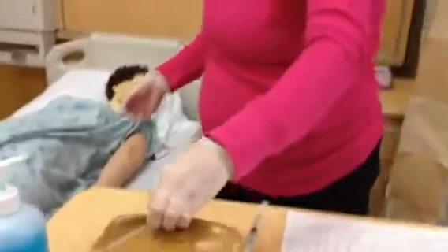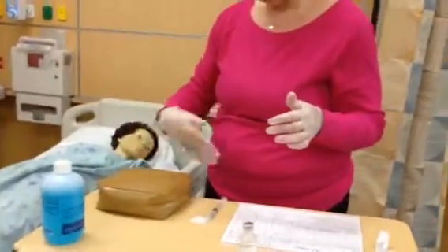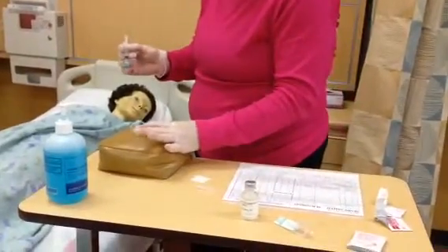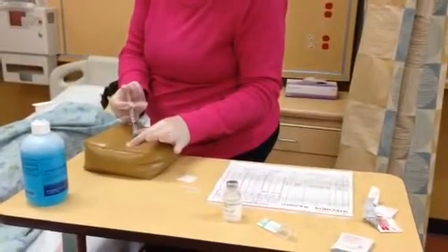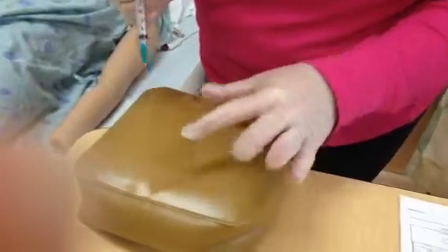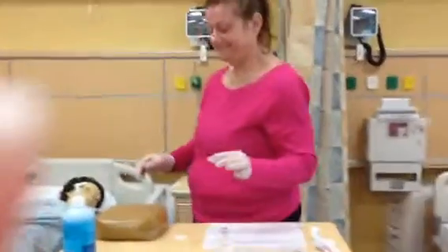I would swab using an outer motion and circle. Because of this injection, I will be using the Z-Track method. So I will get my injection, take the cap off, come up, point, and I will insert. Pull that out, and then I would release. Again, I will take my needle using the scoop method, put this back on, and then throw that into my sharps container.